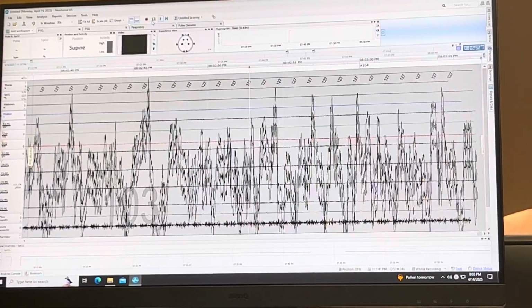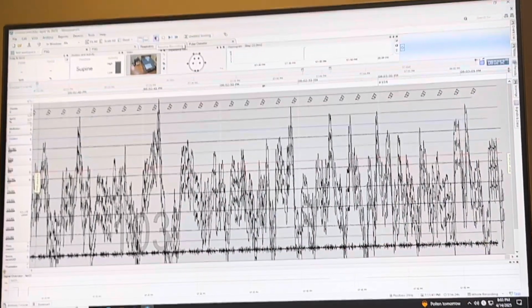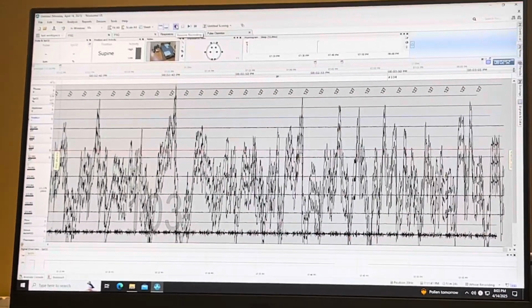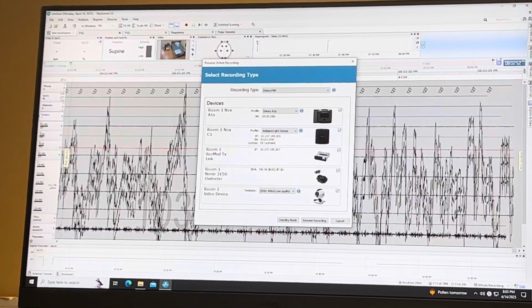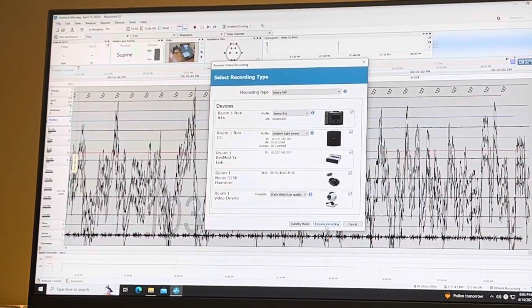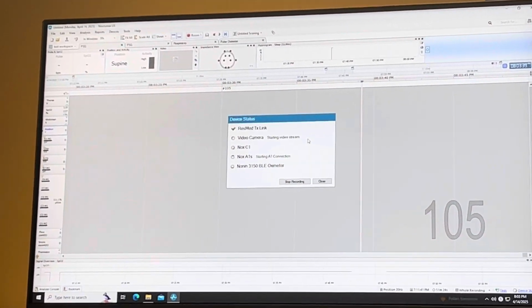Once this room number disappears, like it just did, now this red button is the resume recording button. So we don't have to resume recording or anything. So now I'm gonna change this to the Emory PAP, add PAP into the thing, and I'm gonna resume the recording. So it's gonna go through and it's gonna connect to it.